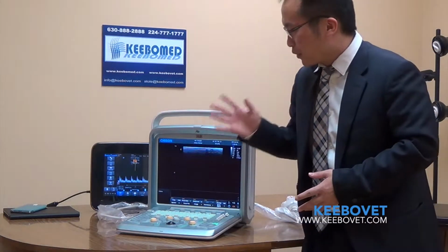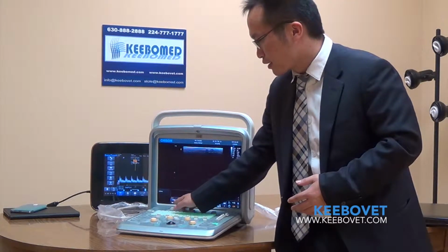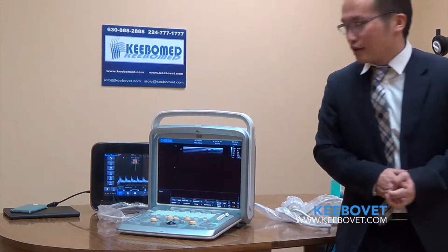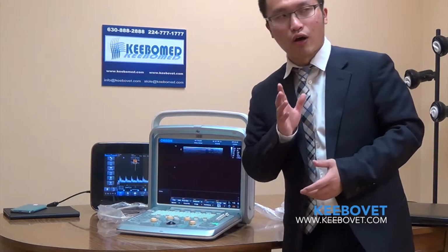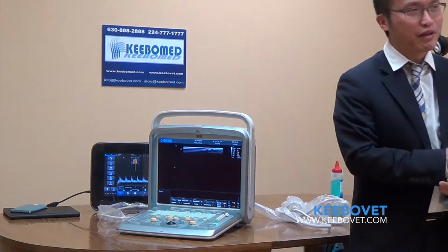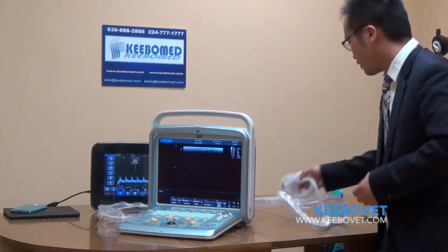And for both Q5 and Q9, our system is very easy to adjust. Touch it to adjust the first line, rotate it to adjust the second line. And also, we have a function on the Q5, we call it one key or AIO. AIO means automatic image optimization. Just for example, it's better I can take the image.